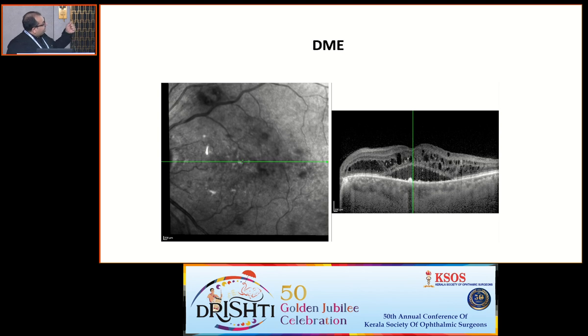If you look at it, the first thing which we see here is a gross edema of the retina. It is called spongiform macular edema, in addition to multiple hyporeflective areas which are seen within the retinal space along with hyperreflective dots, and a subretinal hyporeflective area which depicts the serous macular detachment.